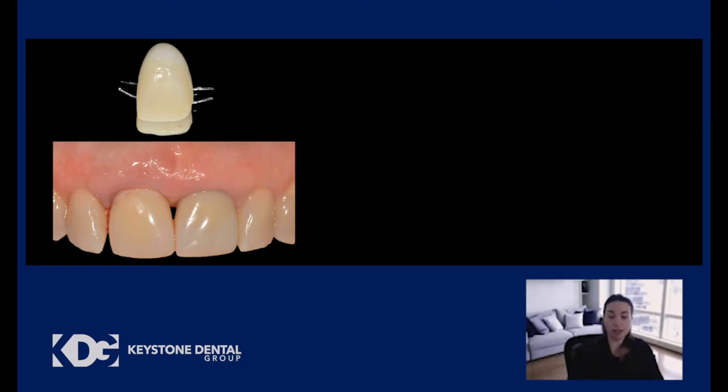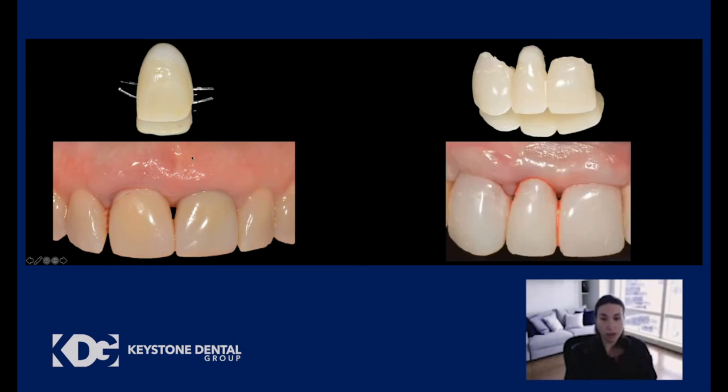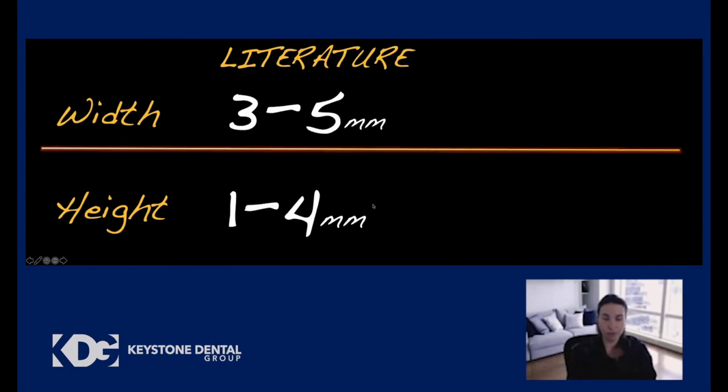that you can see is extending 3 millimeters here in the apical part. In the patients that were having a fixed partial denture as the final restoration, we did prepare the teeth since these patients were going to have a fixed partial denture as the final restoration. The same idea, we had the ovate pontic 3 millimeters into the socket.